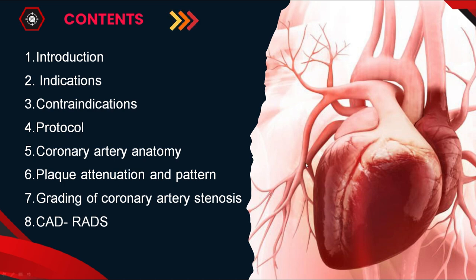In my topic, I am going to tell about the indications, contraindications and the protocol to be used, and coronary anatomy and different types of plaques and their attenuation and grading of coronary artery stenosis, and finally about CAD-RADS.